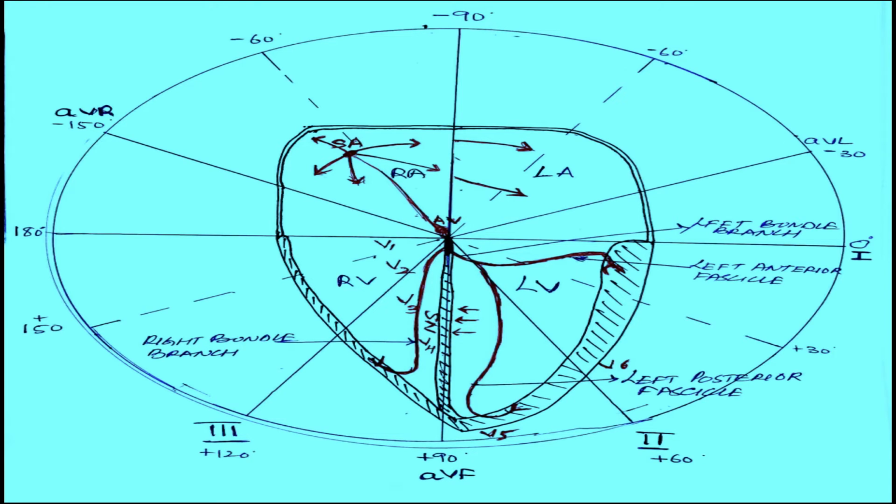And what else will happen? It is from one chamber to the other, from left ventricle to the right ventricle. So what happens? The QRS duration is more than 3 small squares. If it is between the same chamber, then the QRS will not be broadened, like in left anterior fascicular and left posterior fascicular blocks, which we will discuss later on. The QRS is not widened.